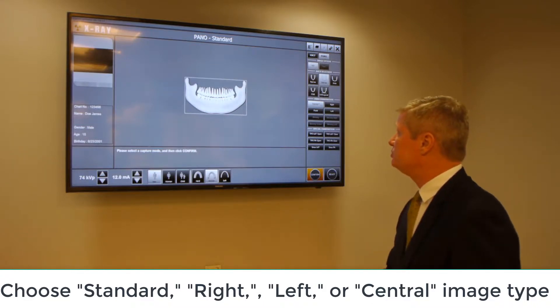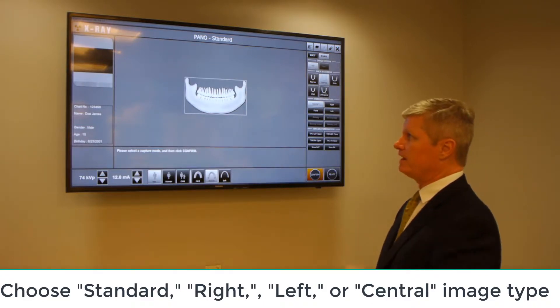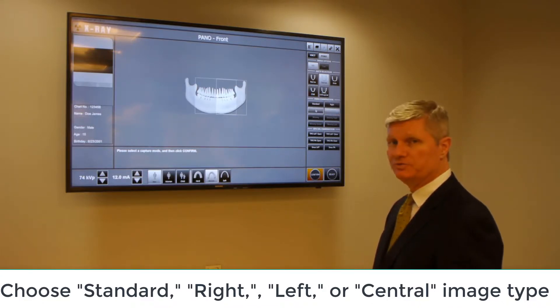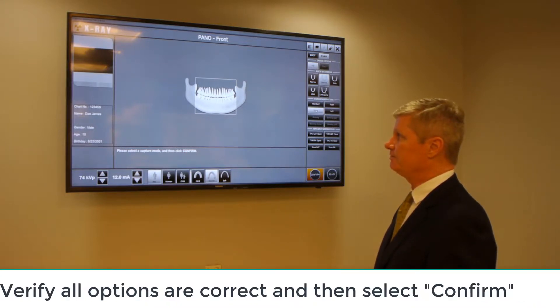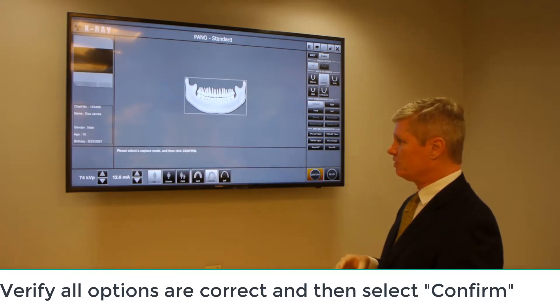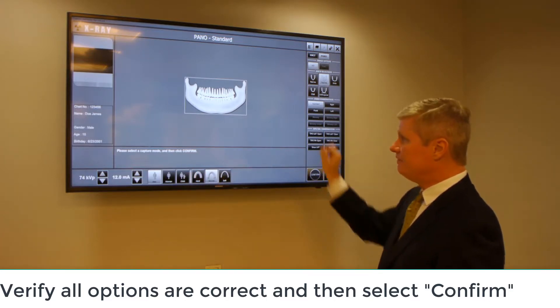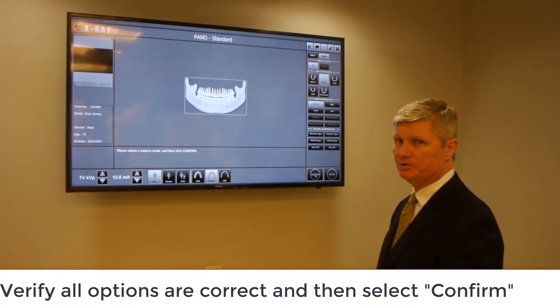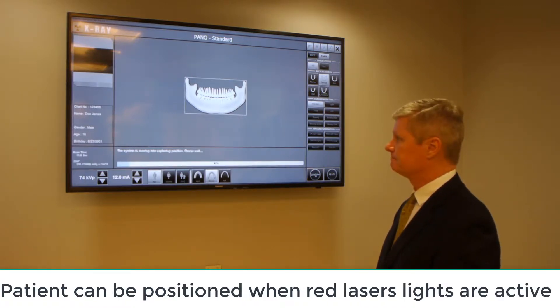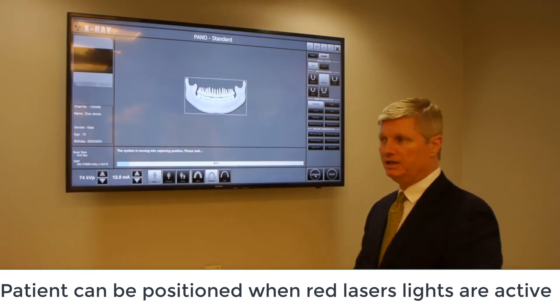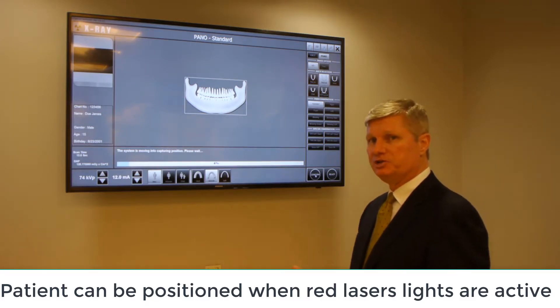As far as our image type, we can choose the standard to do both right and left sides of the arch, just the right-hand side, the left-hand side, or the central dentition itself. Once you've chosen our image types, verify our exposure along the bottom left-hand side of the screen, verify all information is correct, and then click on Confirm to put the device into our capture mode. The system is initializing, please wait.